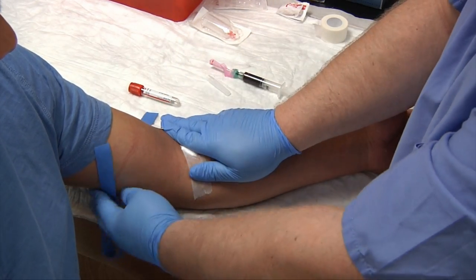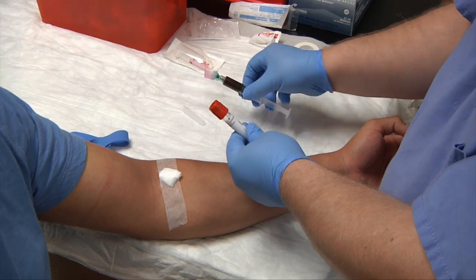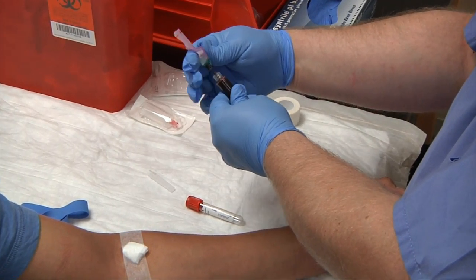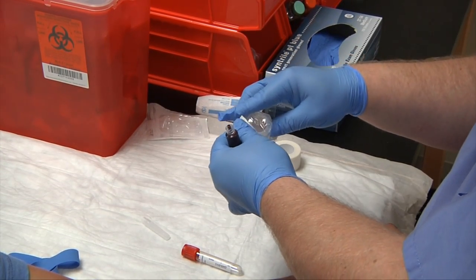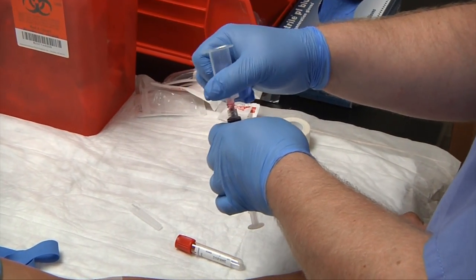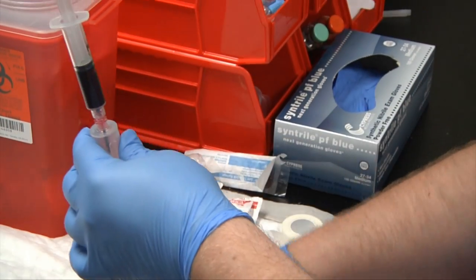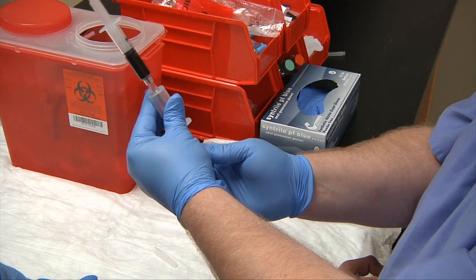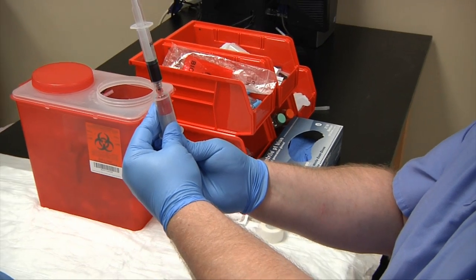Once your patient is bandaged, you need to move the blood from the syringe into the vacuum tube. Very carefully unscrew the safety cap needle and dispose of it in the biohazard. Attach your transfer device — make sure it is in date — it screws in just like the needle. Turn your syringe upright, insert the tube from the bottom with the label facing away so you can see when the tube is done collecting, and gently press in to let the vacuum do the work.